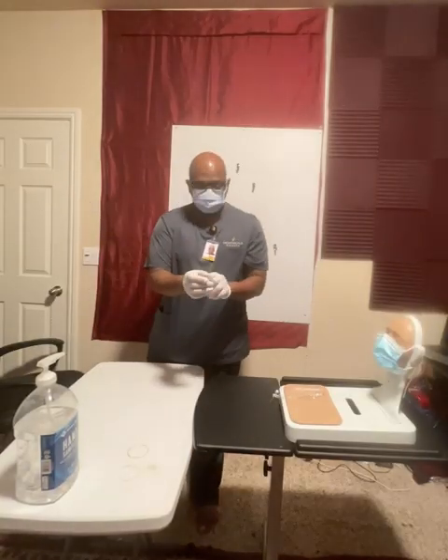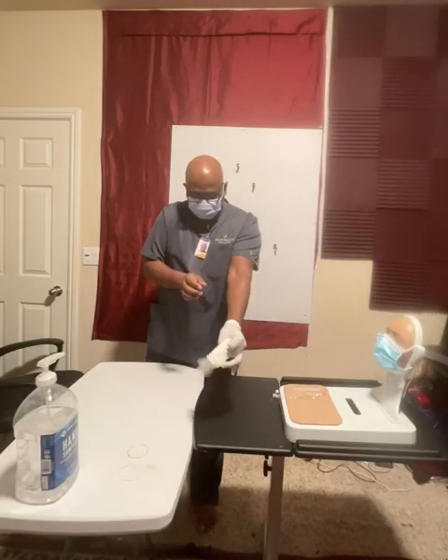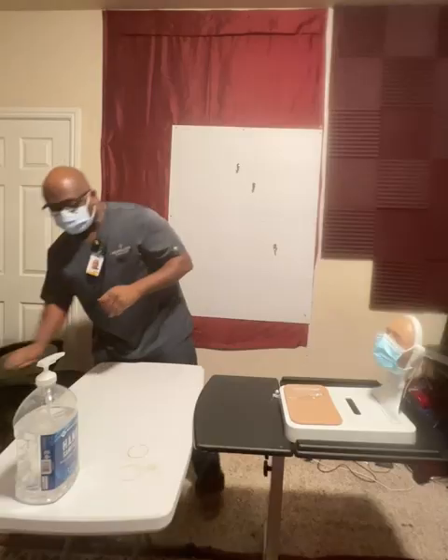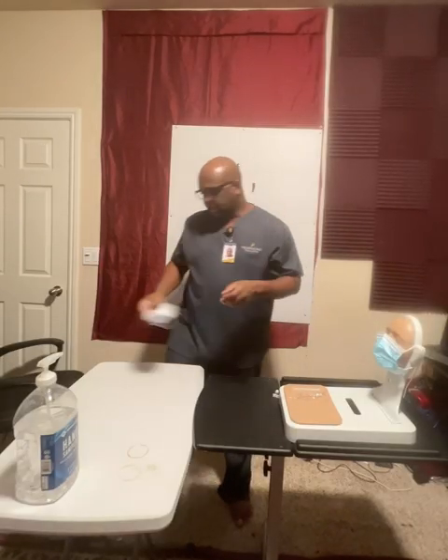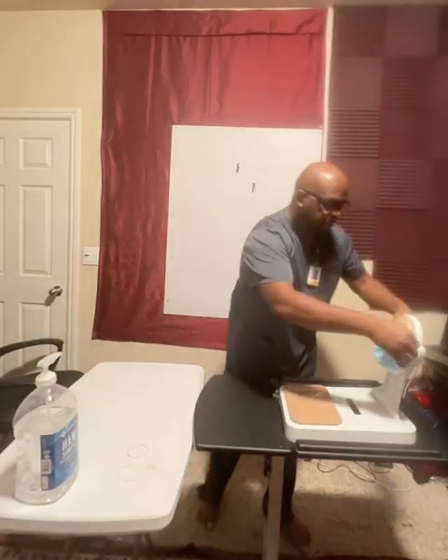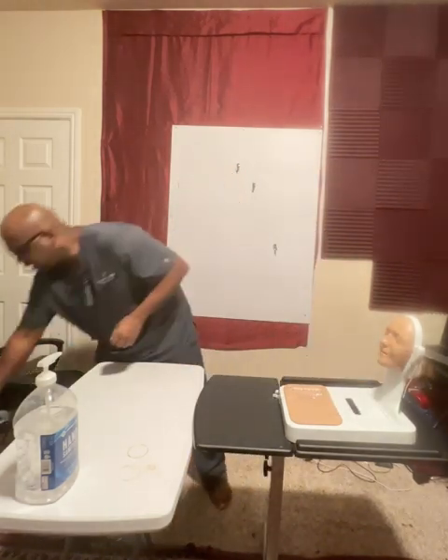Then I'm going to get rid of my gloves, and I'll also put them in the trash can. Now I'll do hand hygiene. Take off my mask, put that in the trash. I'll do hand hygiene again, one more time. Take off the patient's mask. Here you go, Mr. Jones. Your mask is off. Put this in the trash.